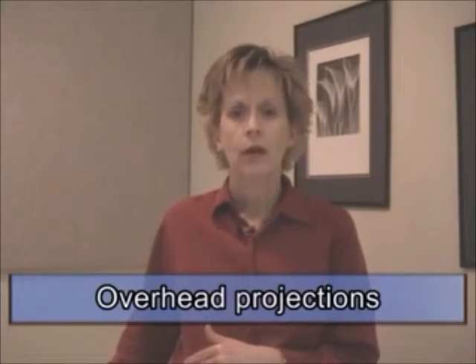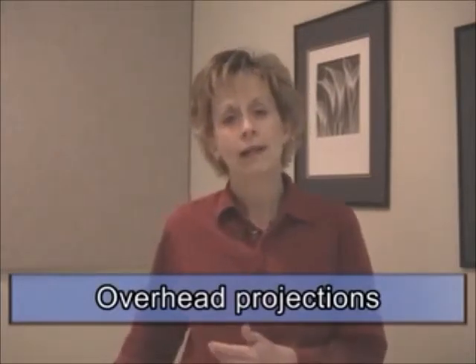The physician leaves, and then we as technologists will come in and take what we call overhead projections or films after the fluoro, and that's the purpose of the demonstration today. Not the fluoro setup or what you do during fluoroscopy, but it's going to focus on the overhead projections afterwards. And I will start with a logical order from the esophagus, stomach, we'll talk about small bowel, and then we'll talk about colon.